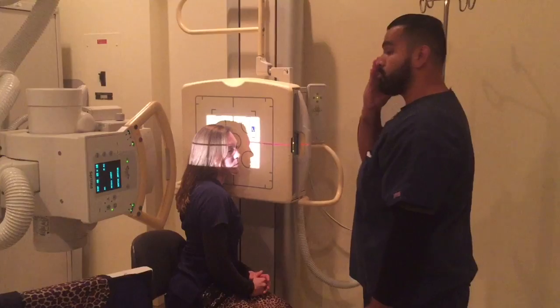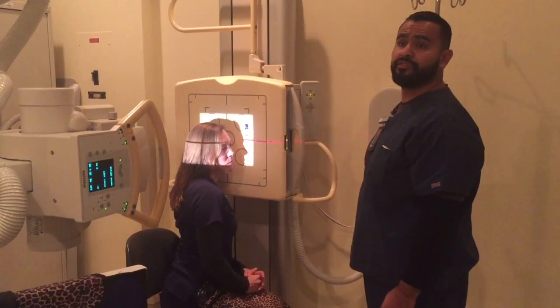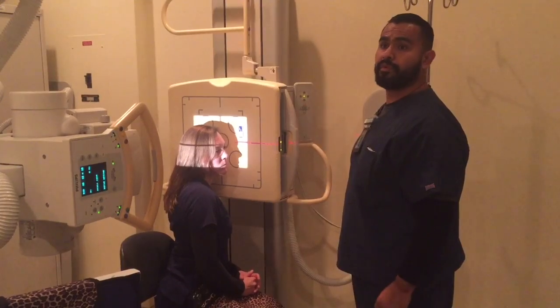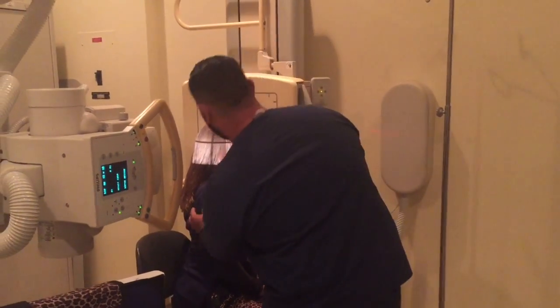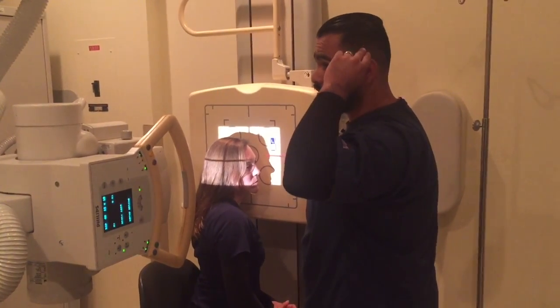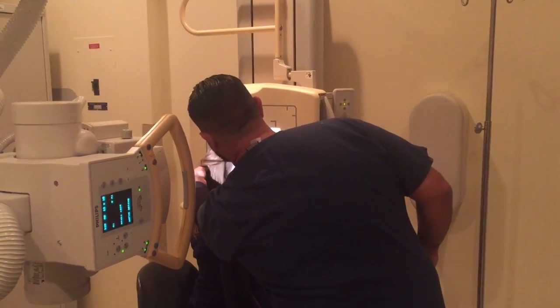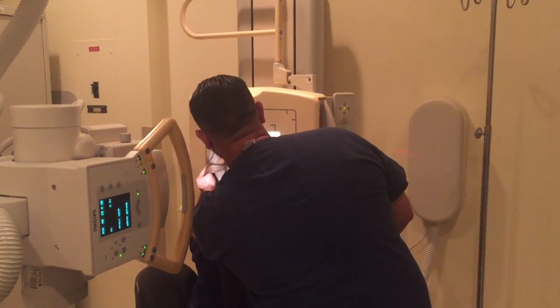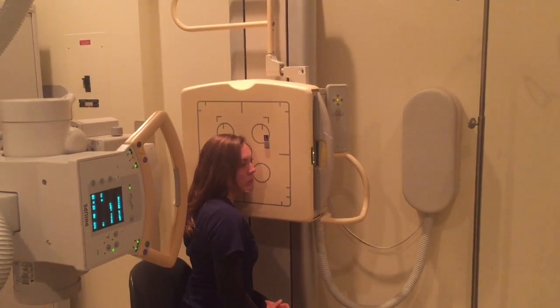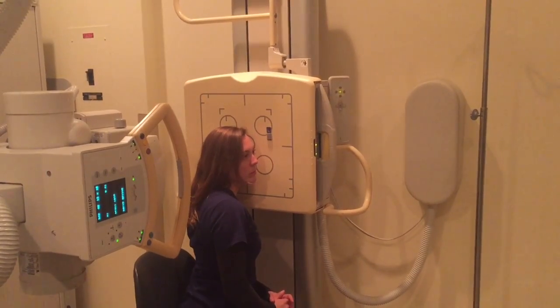Now the mid-sagittal plane will be parallel to the IR. The IOML is perpendicular to the front edge of the IR, and also the interpupillary line is perpendicular to the IR, which I will be doing now, making sure. And I want to make sure that the central ray is 2 inches above the EAM. So I'm just moving the hair slightly to make sure that the patient is in the correct orientation, which she is. I will now take the x-ray. Do not move, please. Don't breathe. X-ray. Go ahead and breathe.